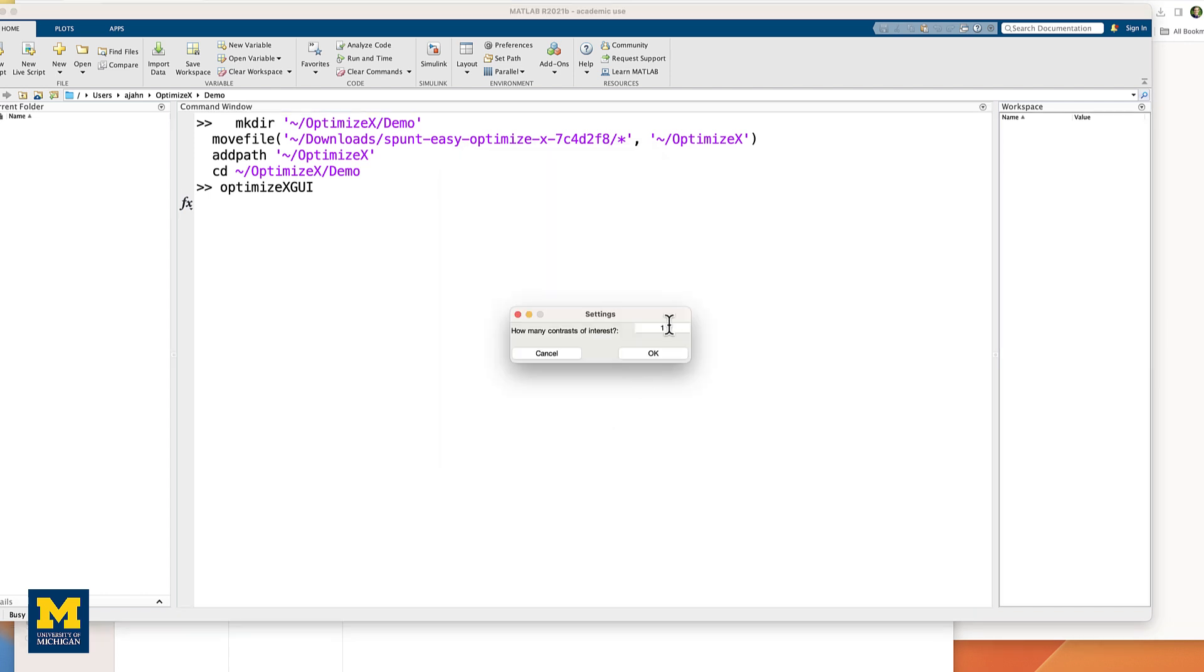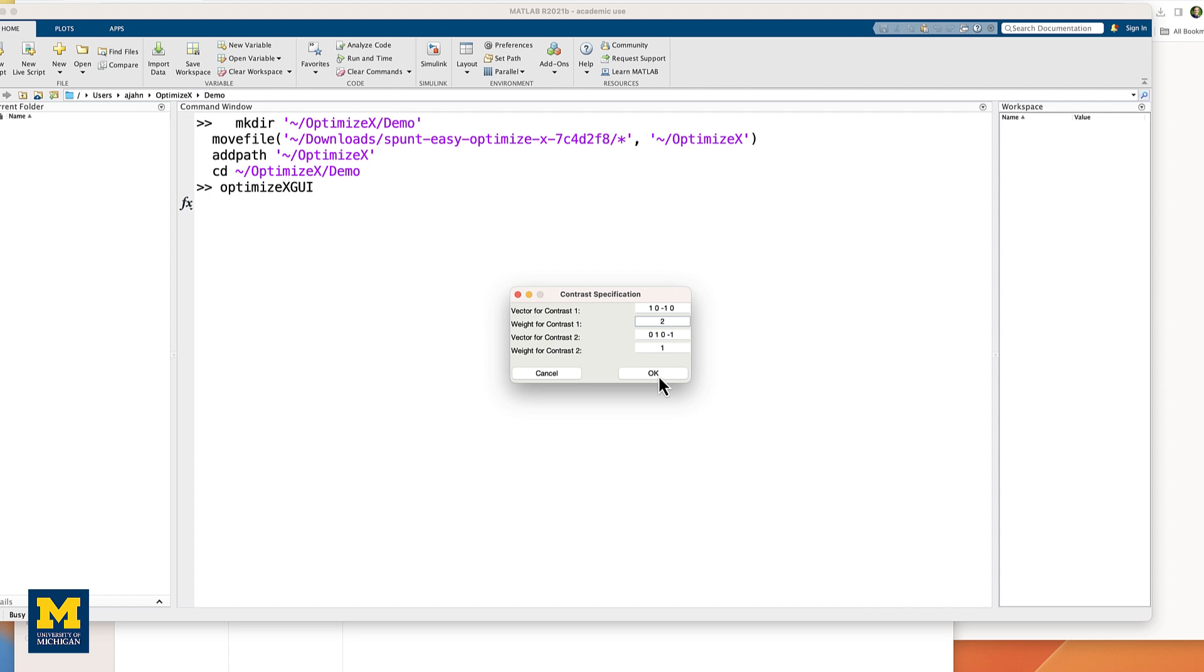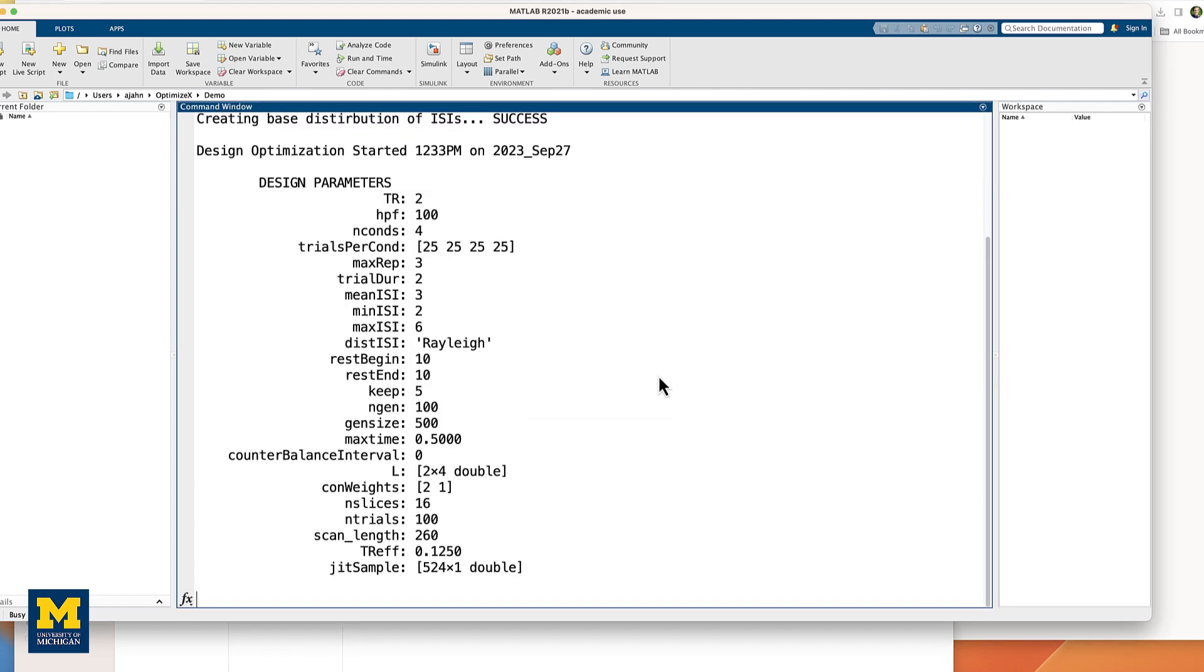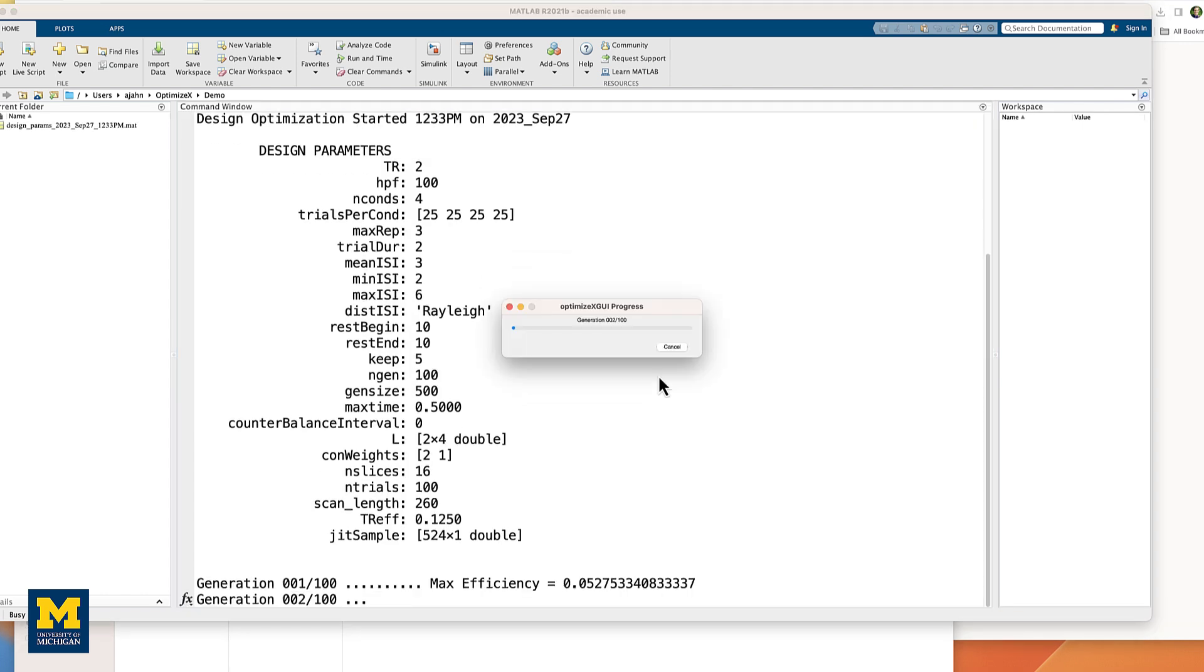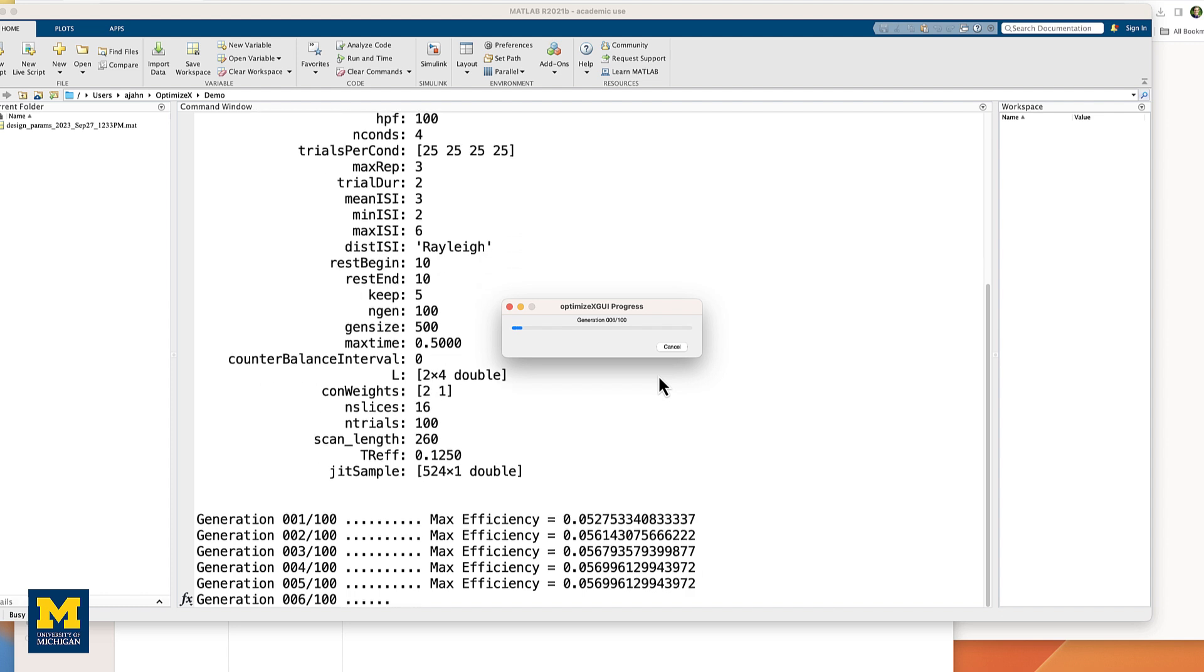You will then be prompted to enter the number of contrasts of interest. Let's enter 2 and click OK. You will then be able to enter the contrasts that you would most like to optimize, along with how important they are relative to each other. For example, we might be interested in comparing regressors 1 and 3 and 2 and 4, with these example contrast vectors. And let's also say we want to give more weight to the first contrast than the second contrast. Keep in mind that these are simply placeholders, since we haven't loaded any actual data. These are just simulations.